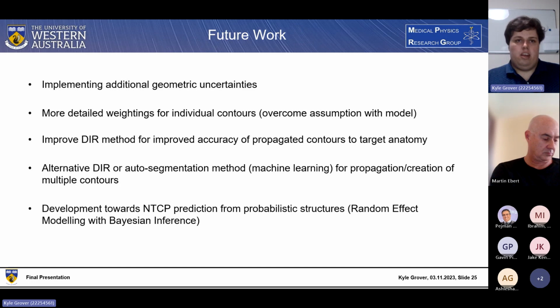through a deep learning method and producing multiple possible contours, and using that to represent a larger summary of the results and reflect the actual uncertainty related to deep learning and auto segmentation methods. Because although they do help with reducing the interobserver variability that does exist and they have their benefit in terms of time, you do start to introduce added uncertainties within those definitions. They have their own intrinsic ones. So there would be that potential for it to be developed and used there.